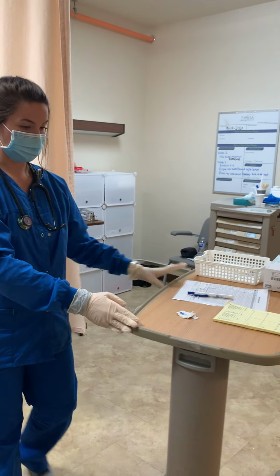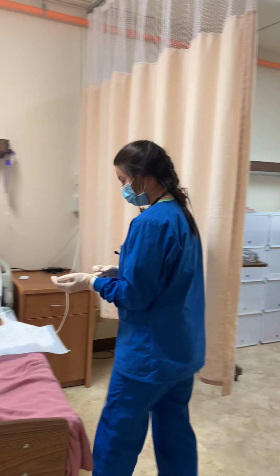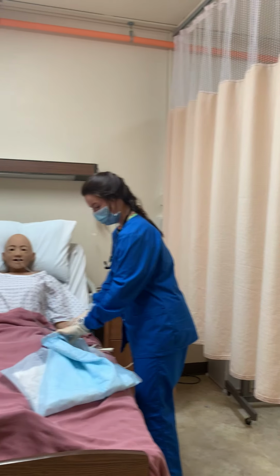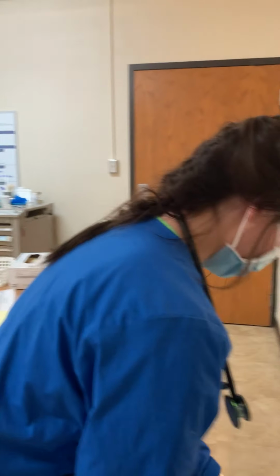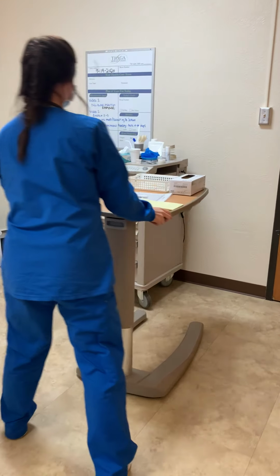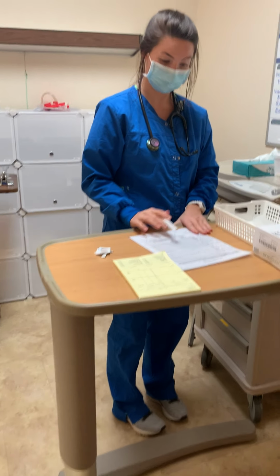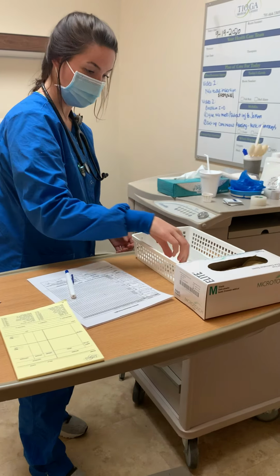And then I'm just going to go ahead, do my hand hygiene, take off my gloves. Okay, Joanne, I'm going to be back here in just 30 minutes to check on you, okay? And that's it. So then I can leave Joanne's room, take off my gloves, do my hand hygiene, and then I'll come back into my bedroom here. Okay, so like I said, then you'd want to do your documentation. This would be into your sharps, or you can set it to the side.